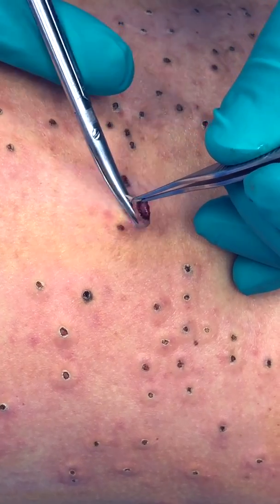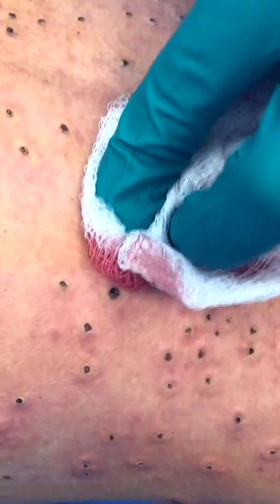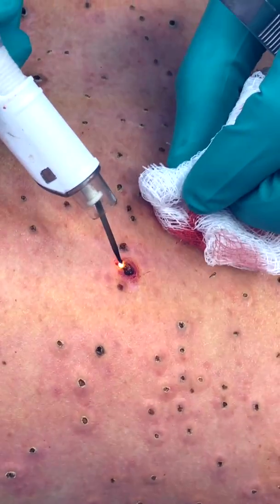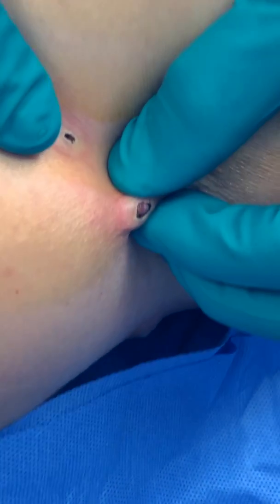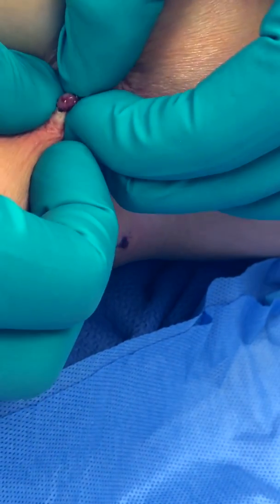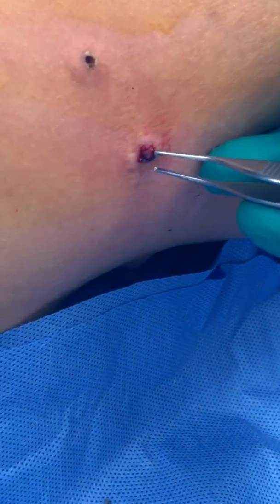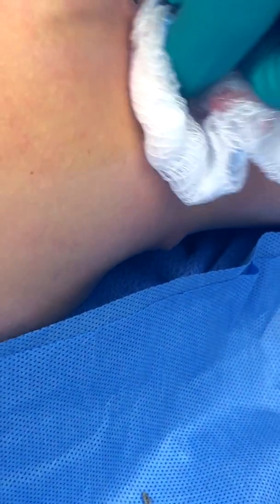If the bump doesn't come out with squeezing, I'll take a scalpel or scissors and cut it out to remove that extra material, since I know there's tissue in there. I'll take a lap sponge and perform a little more electro desiccation on the wound itself — that's going to take a stitch to close. On the next bump, there's still some tumor inside trying to make its way out, so I squeeze it, grasp it, and some of it comes out. I then grasp it with forceps, trim the rest from underneath, and that will also need a stitch.